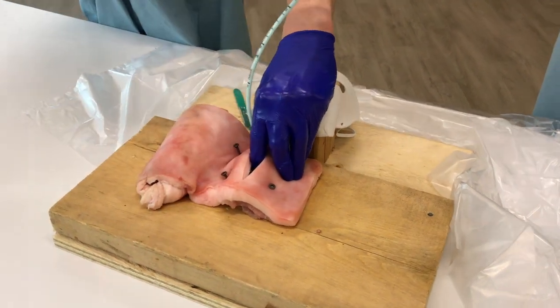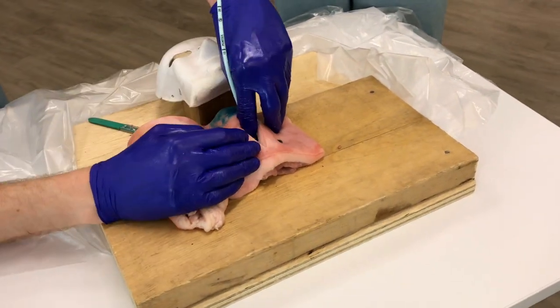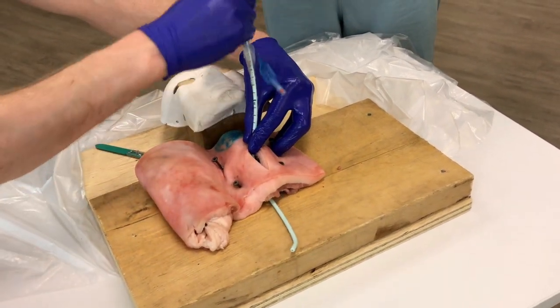I can get Osman to actually twist the whole bougie back and forth, and I really feel that coude tip moving and gain a lot of confidence that I'm in the right space, and then I can continue to advance the bougie until hold up. Okay, I get the tube passed on down to me.